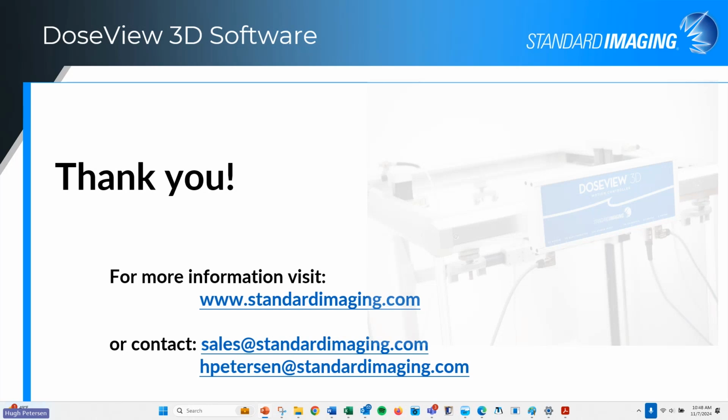And there's enough movement in the leveling of the system to be able to account for any couch sag, because with the Halcyon unit and the weight on the water Phantom, there's some couch sag, but you can account for that with the leveling. But that looks like all the questions I've got.